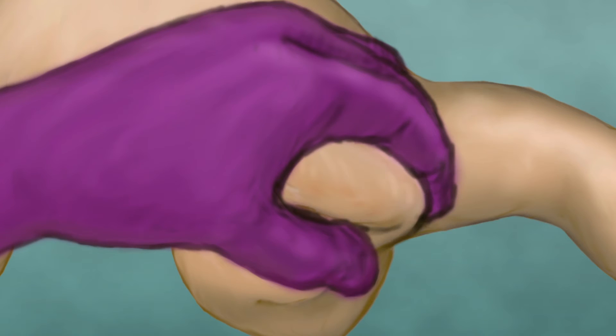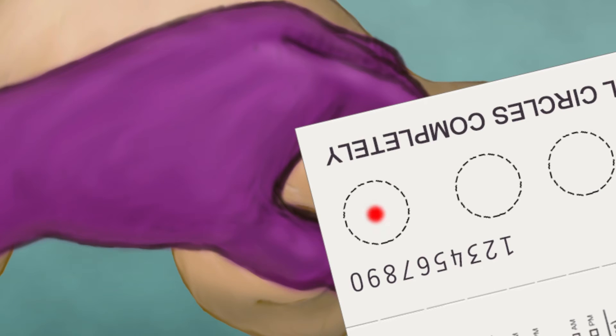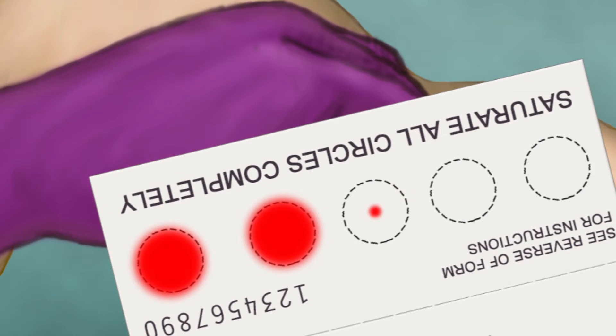When the second drop of blood forms, press the back side of the filter paper test card against the infant's heel, while exerting gentle pressure on the heel. You will need enough blood to completely fill and soak through the circle. Use only one blood drop within a single circle, but make sure that all of the circles on the test card are filled.